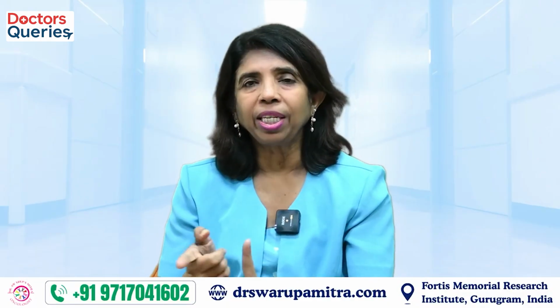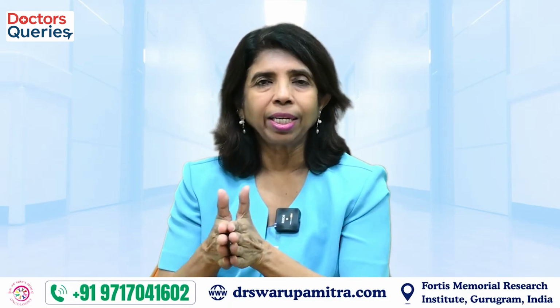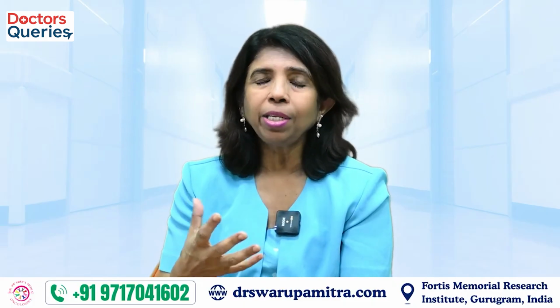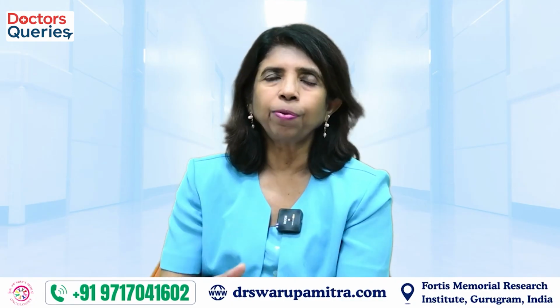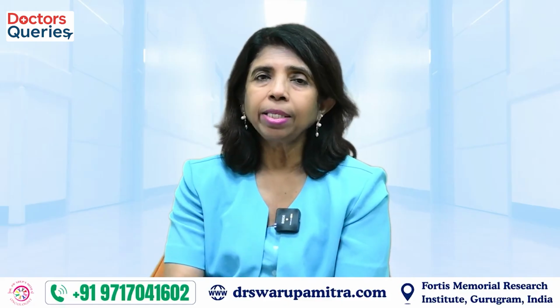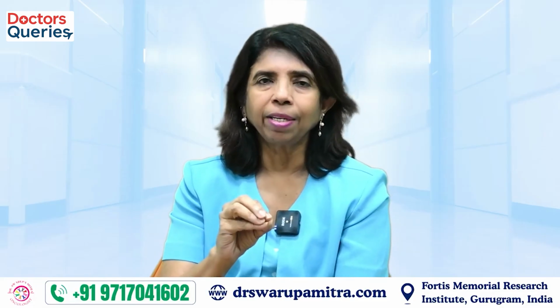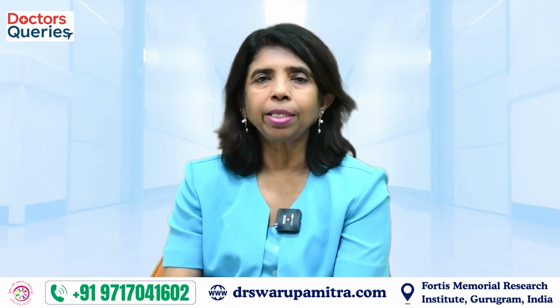We need 2 to 3 days time in our department when we plan the treatment. In this 2 to 3 days we do not need the patient, and in this time we take help from the patient's scans, the histopathology report, and all the examination findings which we have, and we prepare a plan for the patient. Generally 3-4 plans are prepared and the doctor chooses the best plan. Which is the best plan? The best plan is that plan where the normal areas can be protected maximum and the maximum dose can be delivered to the target area. So after a good plan is made, we call the patient.